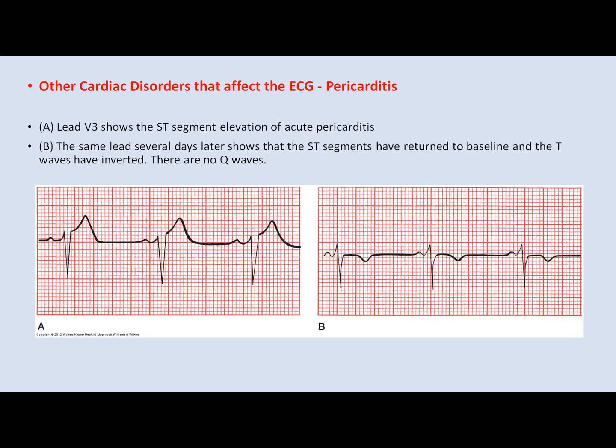Pericarditis. Pericarditis is the inflammation of the heart, the pericardium, that can cause fluid to build up in the sac called pericardial fluid. And when they have pericarditis, usually they have ST elevations, not just like a heart attack, but all over the ECG. So if there are ST elevations in all the leads, it's not a heart attack usually. And usually they have fever, they feel like flu, like feeling sick, and those symptoms. See, so if you have diffuse ST elevations, meaning more than the typical geographic area of the heart, then you think about pericarditis. Especially, they usually have low-grade fever and things like that.